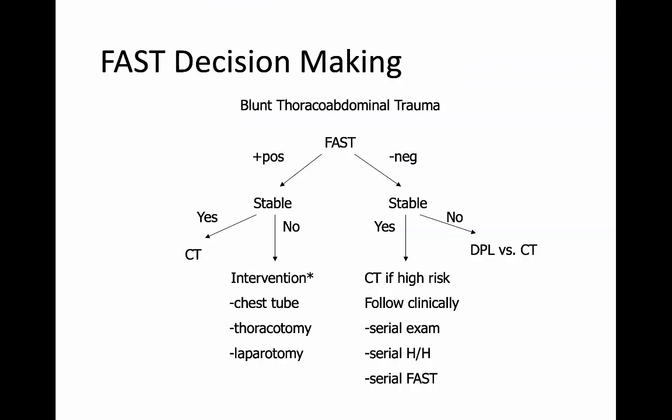Now, our decision making can be pretty straightforward, and mostly we're going to talk about blunt trauma, although in penetrating trauma, the FAST exam, especially the cardiac views, can be super critical. Let's talk about blunt trauma first. So the FAST exam, they've got blunt trauma. You do the FAST exam as part of your workup, and let's say it's positive.